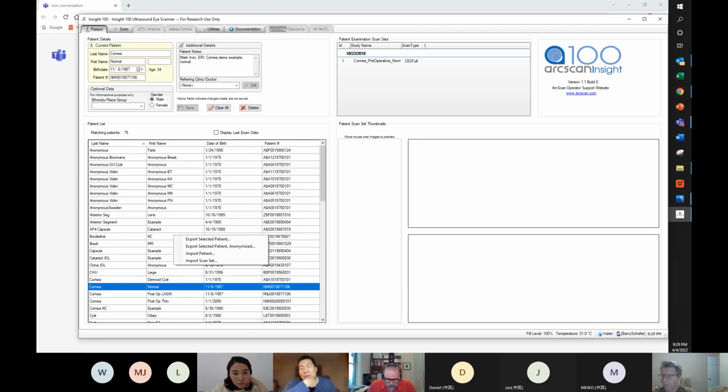So, Barry, by doing this, we will be able to see how the eye opened when they did the measurement, how the eyelid opened, something like that. Yes, you can see everything. And there's information within the ScanSet file. We can tell exactly how the computer worked, what the settings were. We can tell everything about it. But this will give you the full picture, as if you were there at the instrument taking all the measurements. And I'm going to send you an email on how to do that, okay?